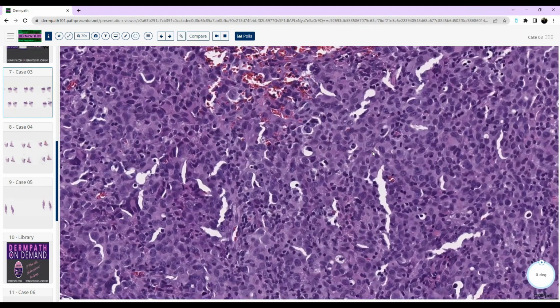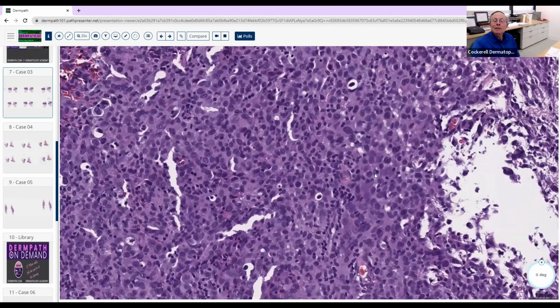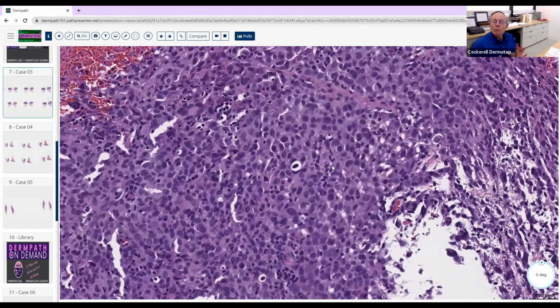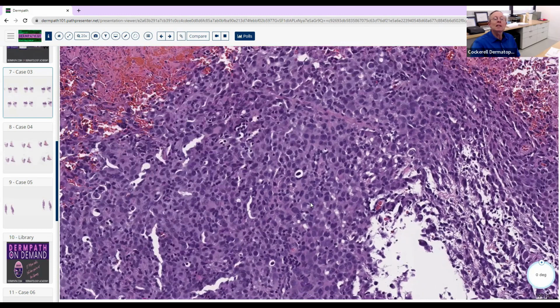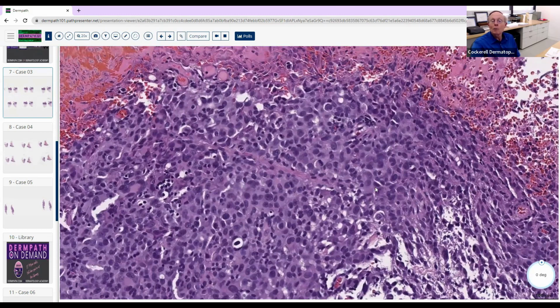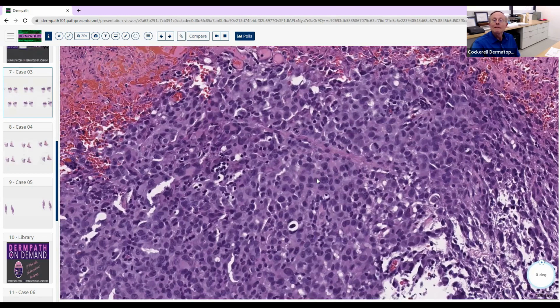It's a good point when you see something and say, gosh, that looks like histiocytes at low magnification. What are some of the morphologies of histiocytes that we see histologically? That's kind of an open-ended question, but can you think of some morphology that histiocytes can assume? Like the foamy kind? Good. Foamy histiocytes. Excellent. Like a Touton giant cell's got foam in there, maybe a foamy histiocyte of a xanthoma.